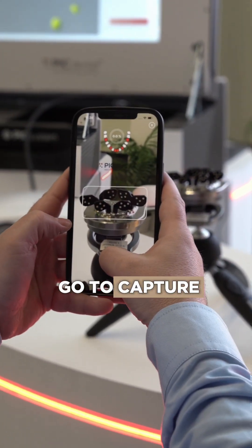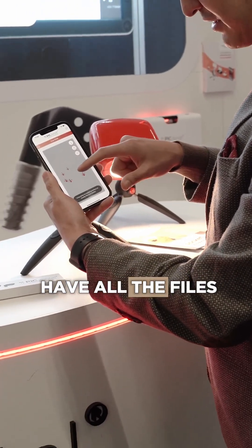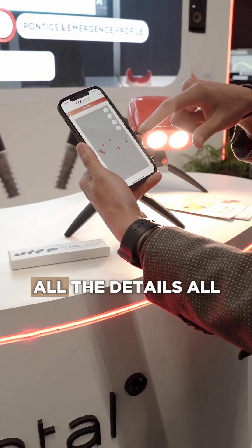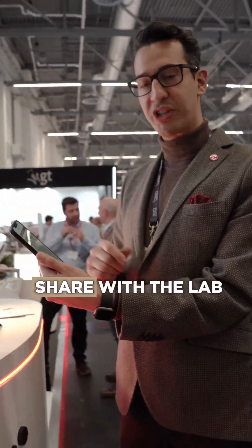Go to capture, and look here — I have all the files: very precise implant position. We can select them, all the measurements, all the details, all the information. And this is exactly what we need to share with the lab.